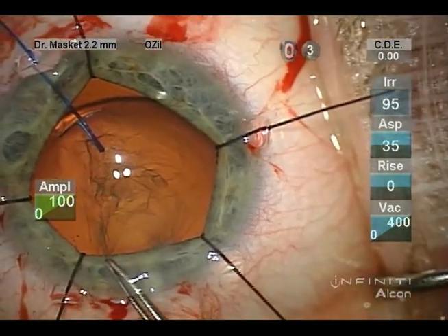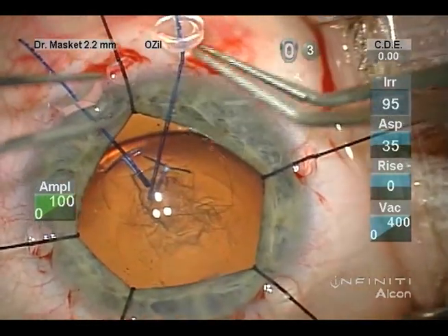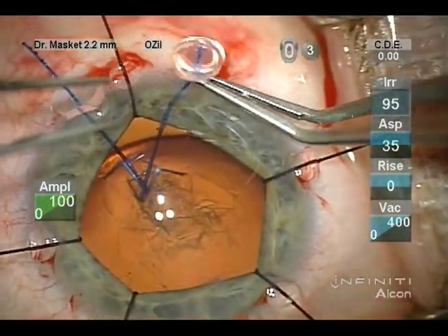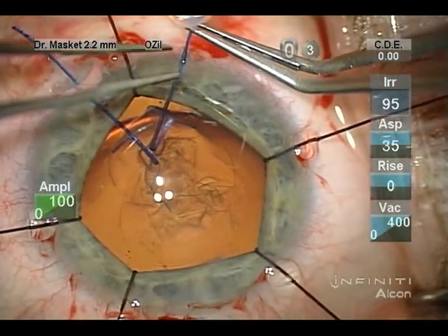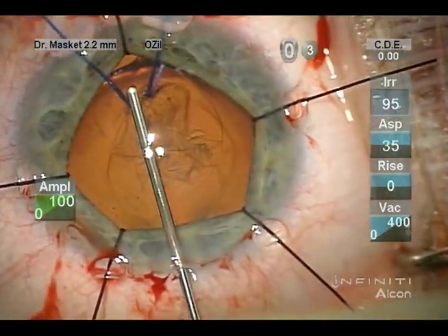Sometimes trypan blue is helpful to identify the capsule edge. In an attempt to further bring the lens into normal position, a second Yaguchi-Kazawa hook is passed.